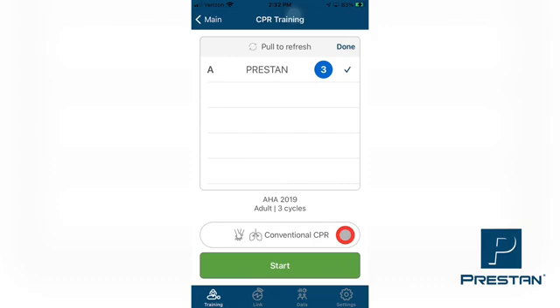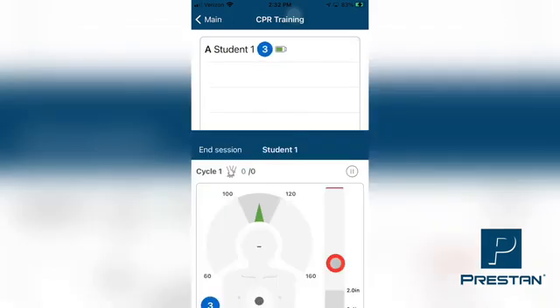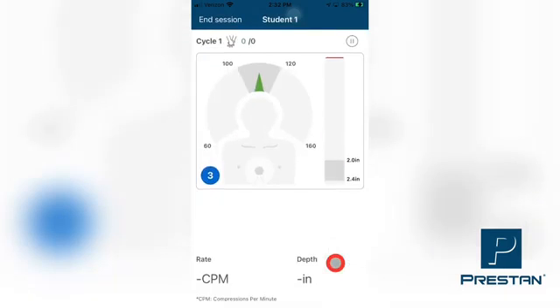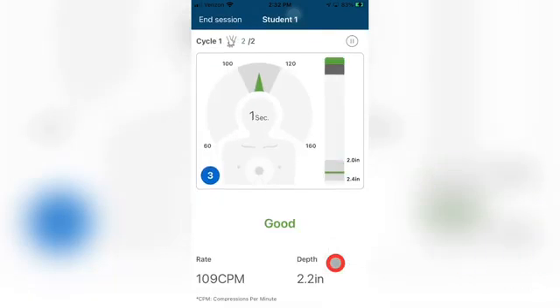Or, Conventional CPR, where the students will perform both compressions and ventilations in combination. The selected method will show on the face of the button. For instance, if you are wishing to train a conventional CPR method, the button will show the words Conventional CPR. You are now ready to start the training. Press the green start button at the bottom of the screen, and your students can now start practicing and gaining confidence in their CPR skills.